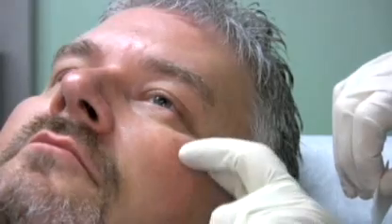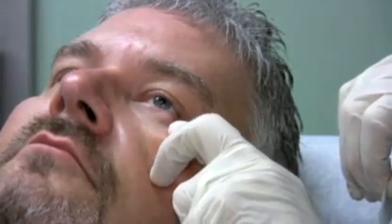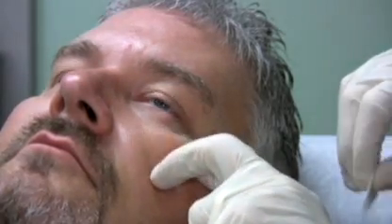This morning we have a 42-year-old gentleman who presents with a six-week history of a little inflammatory mass over his left lower eyelid. It's been there about six weeks, gradually increased in size, and is a chalazion. What we're going to do is inject 0.1 ml of steroid solution right into the mass itself.